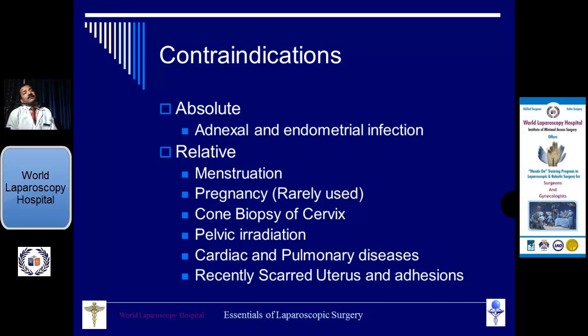Another problem is there are more chances of intravasation. Another problem is, he is correct, there is very bad vision, because blood will absorb all the light and you cannot see anything. So this is a contraindication, but relative, because sometimes in an emergency you have to do it.